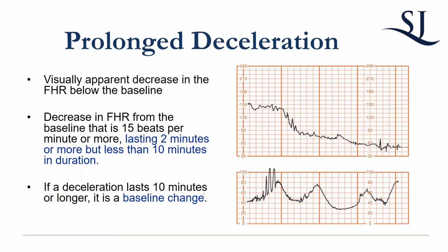So if that happens, because I told you there's external monitors, right? But the intrauterine pressure catheter is how you would get the contractions, and that goes inside of the uterus. There's something called a fetal scalp electrode, where you basically put the tube on the baby's head, and that will get your fetal heart rate, and then you can take the external monitors off. And that's actually preferable when you can do it. It doesn't bother baby at all, especially because in labor, usually there's a little bit of swelling on the baby's head. So it doesn't matter.